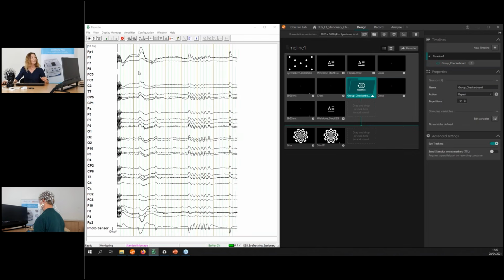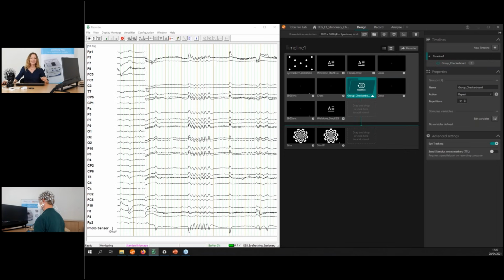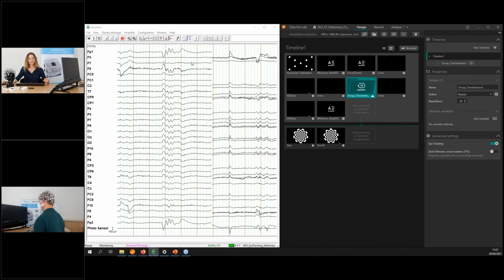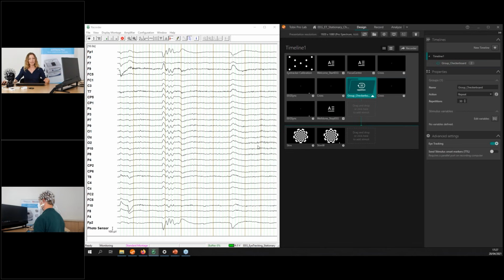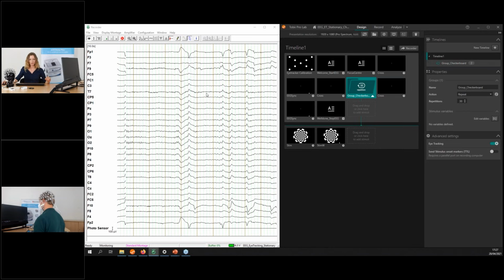Nice, okay. So if Eduardo blinks a few times, you're gonna see the blinks on the frontal channels. Maybe if you close your eyes, we'll see some alpha here in the occipital channels, as you can see. Yeah, all right, perfect. So our EEG data looks quite fine. And we're basically ready to go.